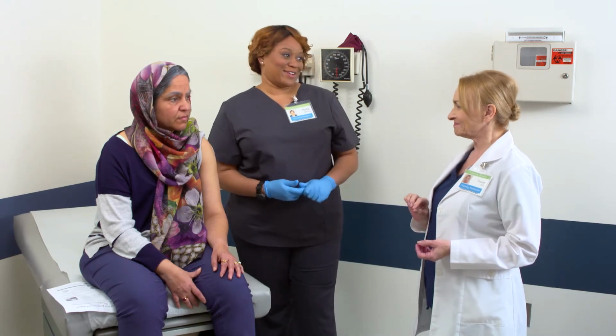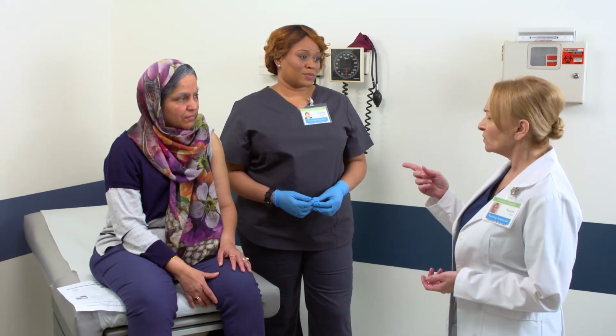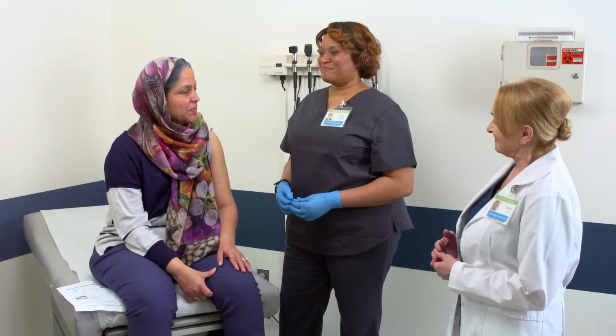I love that trick. This vaccine injection in the deltoid does not require the Z-track method, so I plan to simply pull the skin taut with 2 fingers to ensure the needle is in the muscle. I agree, but can you show me how we would use the Z-track method since we're working through IM injections anyway? Go ahead, Pasha. We all have to learn sometimes. Use my arm and show Miss Hill how to do the Z-track thingy.